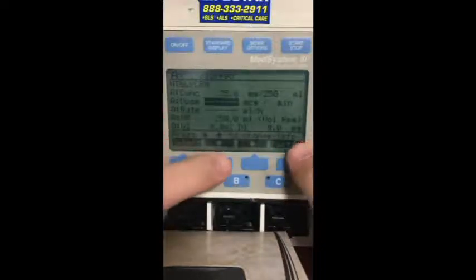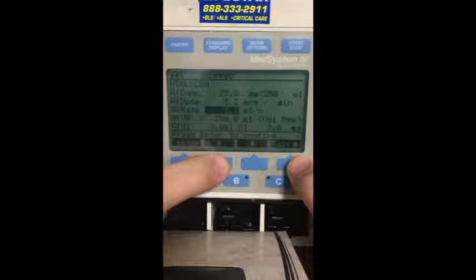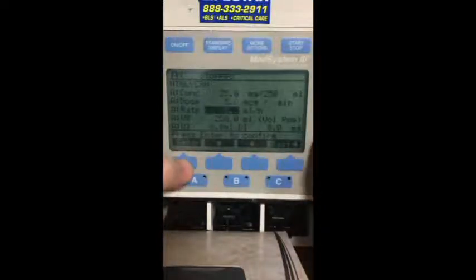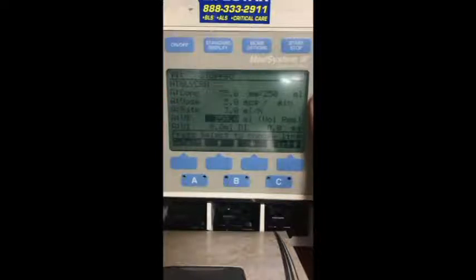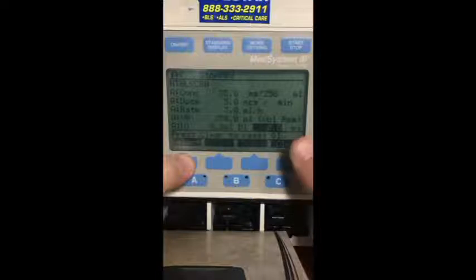Now your dose, we want to start at 5 mics per minute. And notice that it automatically calculates the rate. If I increase the rate, it increases the dose. So our concentration is 25 milligrams in 250 mLs. The dose is 5 mics per minute, and the rate is 3 mLs per hour. Our volume remaining in the bottle is 250 mLs. Our volume that we have already infused is 0. And our dose infused, we've infused 0.0 milligrams of nitroglycerin. And then you can obviously clear these out.